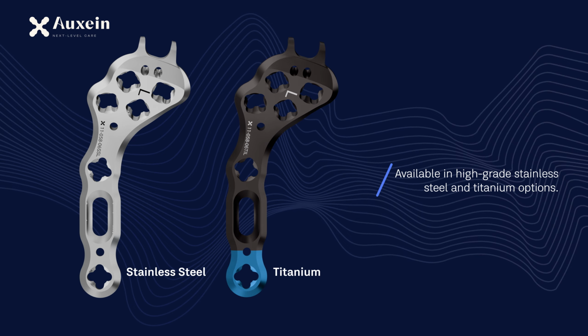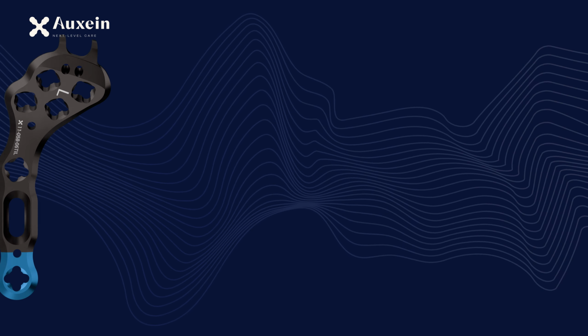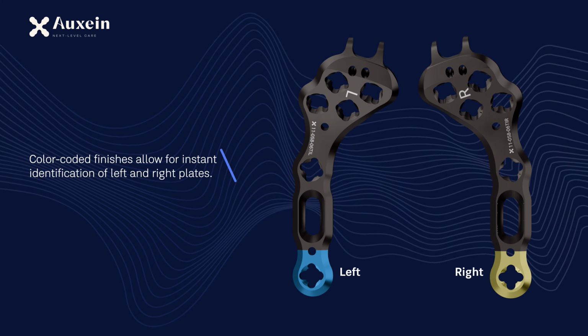Available in high-grade stainless steel and titanium options. Color-coded finishes allow for instant identification of left and right plates.